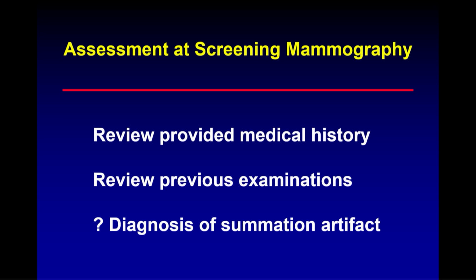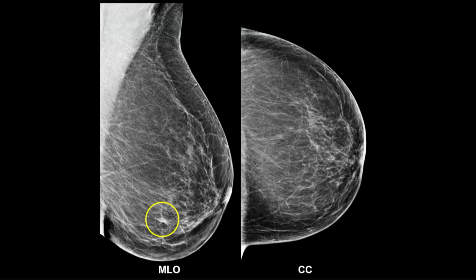Many radiologists don't do it. It takes a little bit longer for a screening exam because you have to go back and look at other priors. But it helps you avert the recall and get your recall rate down without any danger of missing any cancers, simply by looking at more priors, and you will understand why.